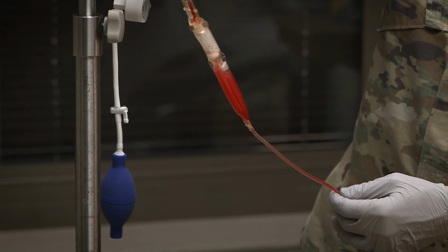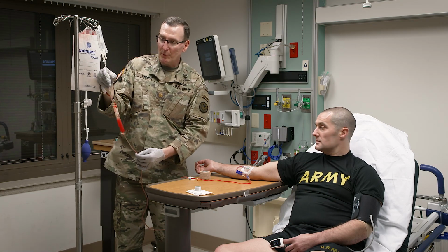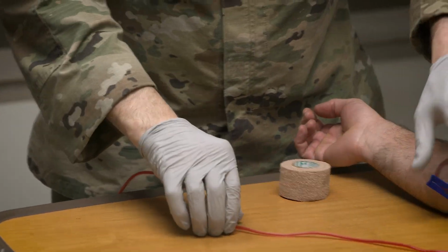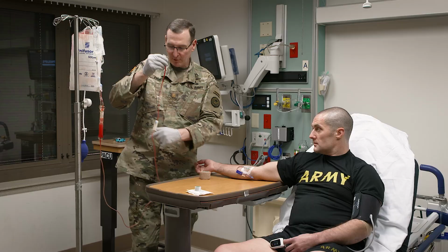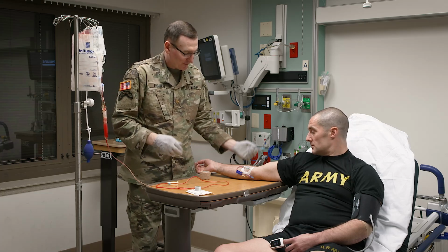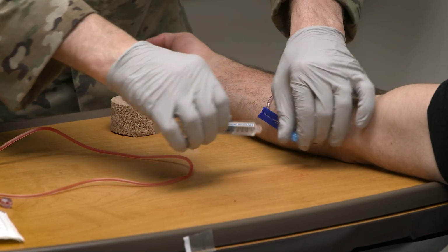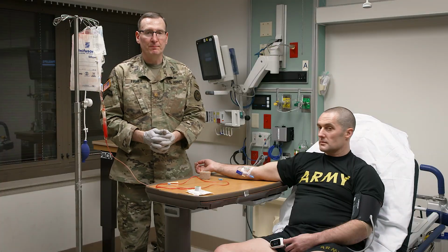And once you are satisfied that you have cleared the line appropriately, go ahead and close the roller clamp on there. Go ahead and close the roller clamp here. You can go ahead and disconnect the administration tubing from the saline lock. And from this point, you can flush the saline lock appropriately and prepare to treat your casualty for other issues.